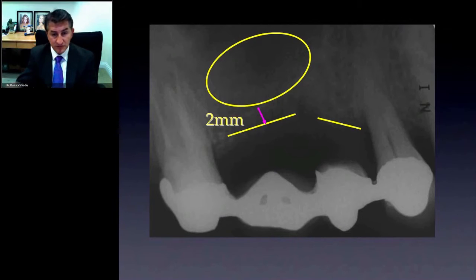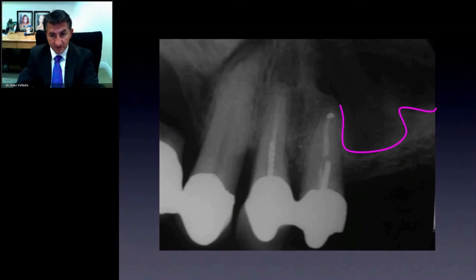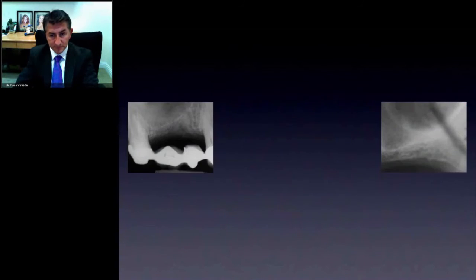We need to keep that tooth stable for 12 months. So we'll prepare the tooth and give a provisional here, from number 2 to number 5, and then while this is healing, we have a nice fixed provisional, and we're holding on to this tooth as much as possible. On the other side, same problem. We need grafting and a long treatment time. So this patient's going to have a sequential 12 to 14 month treatment time, and then we have to evaluate the most posterior tooth there.